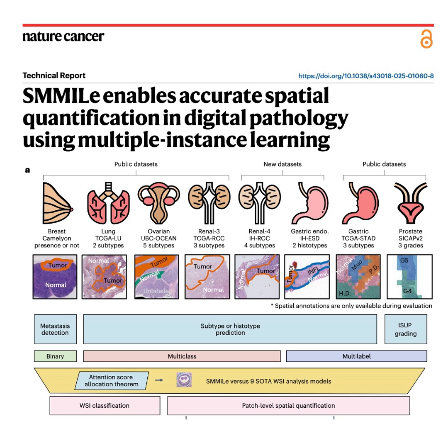Right. But we have an AI that consistently beats other state-of-the-art models in drawing boundaries. That raises a really uncomfortable question. The AI is being graded against the ground truth, the manual boundary maps drawn by expert human pathologists. What happens when the human and the machine disagree? Well, the researchers wanted to know exactly that.